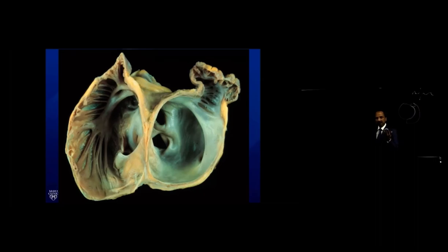In front you get the valve, to the side you get the non-coronary sinus, thinner there. That's the part where you're most likely to perforate. It's not a common site for perforation because we don't do much ablation there. But the simple thing is to remind yourself that if there's no electrogram there or very little electrogram there, you don't need much ablation.